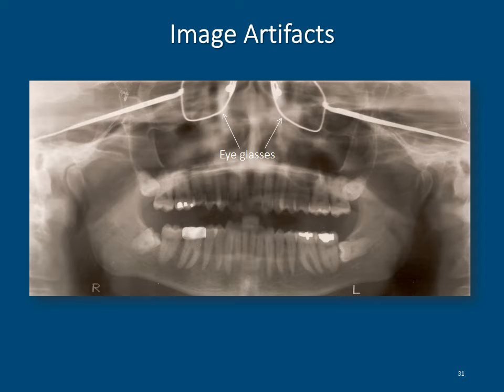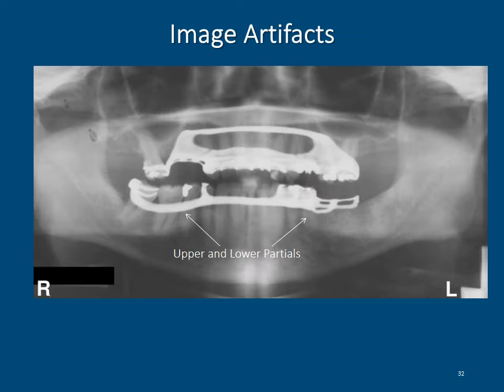In this image, the patient's glasses were left on, so you can see the impression of how they appear on the radiograph. This image is of upper and lower partials that were left in the mouth during the radiographic exposure.